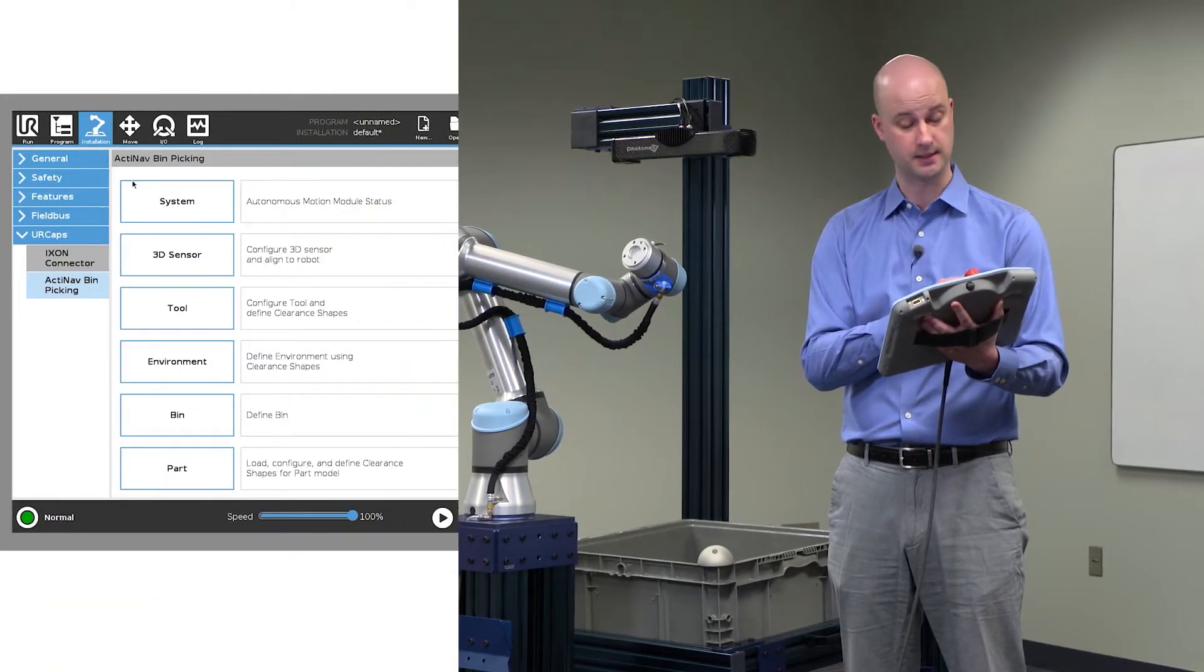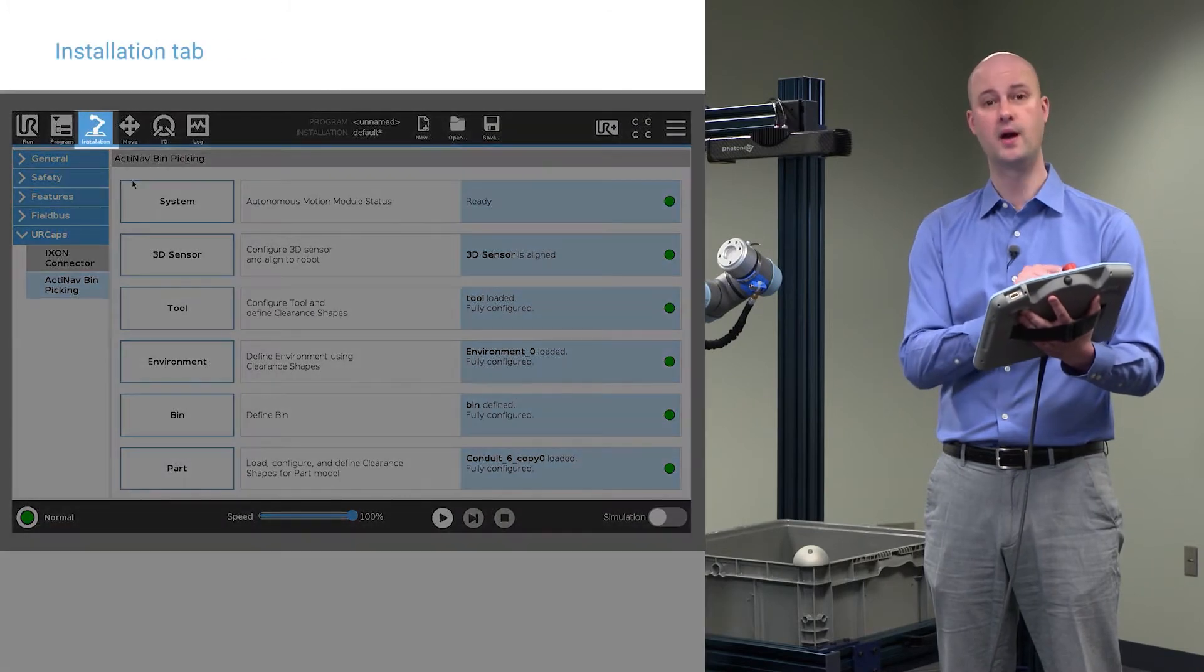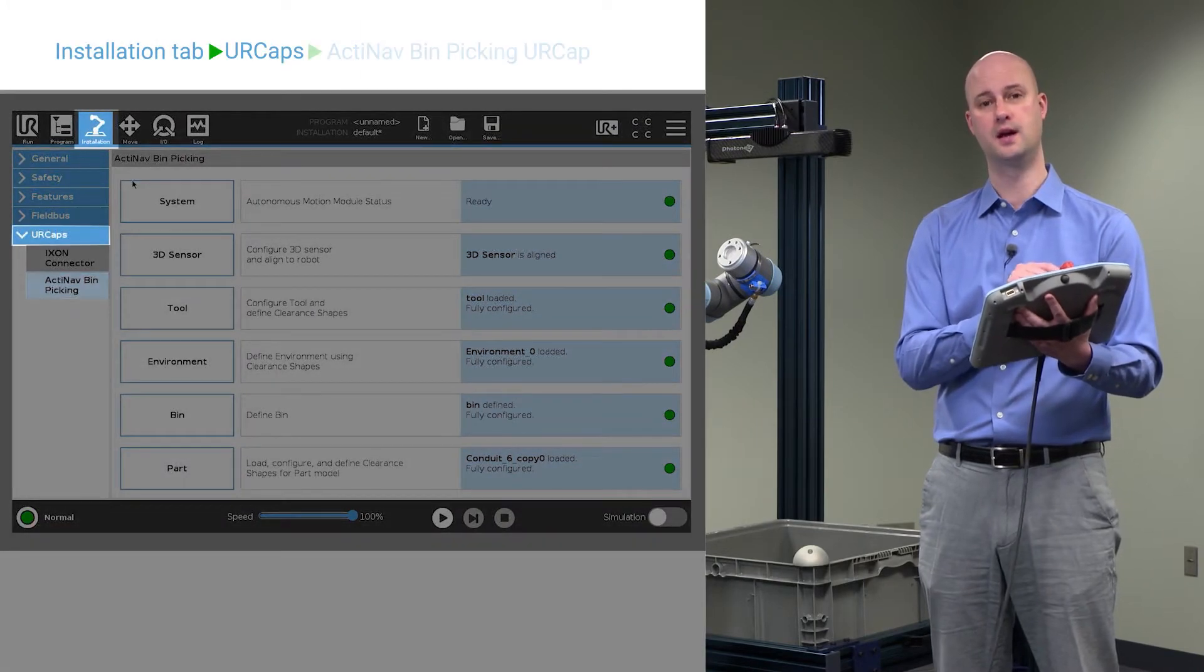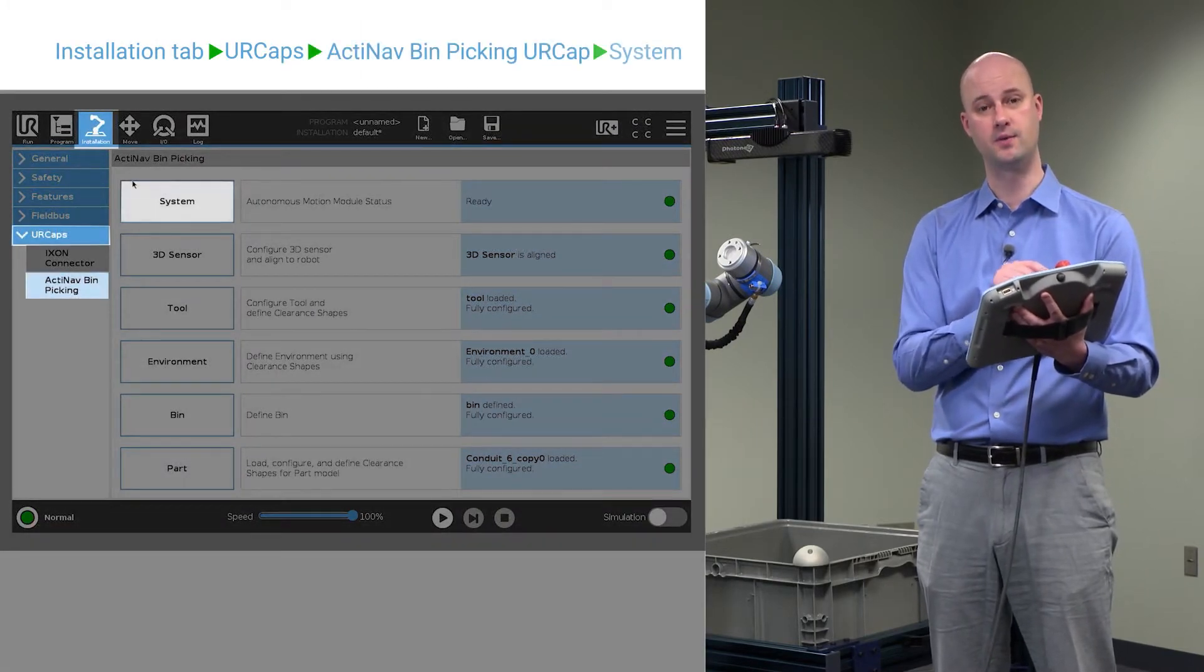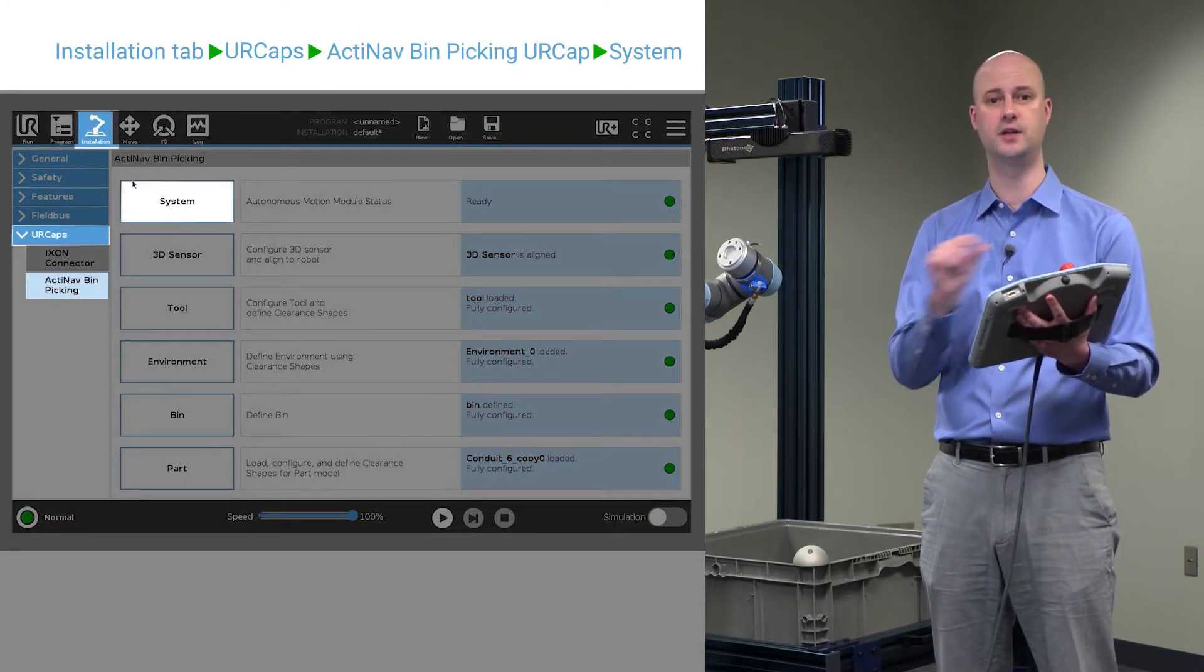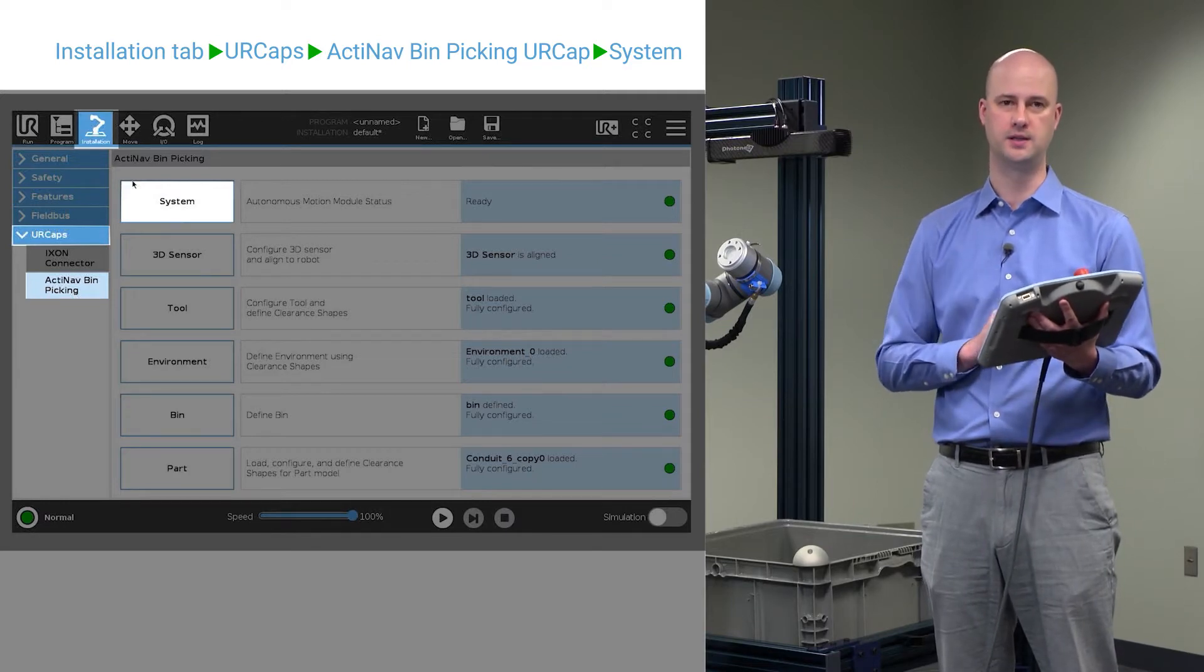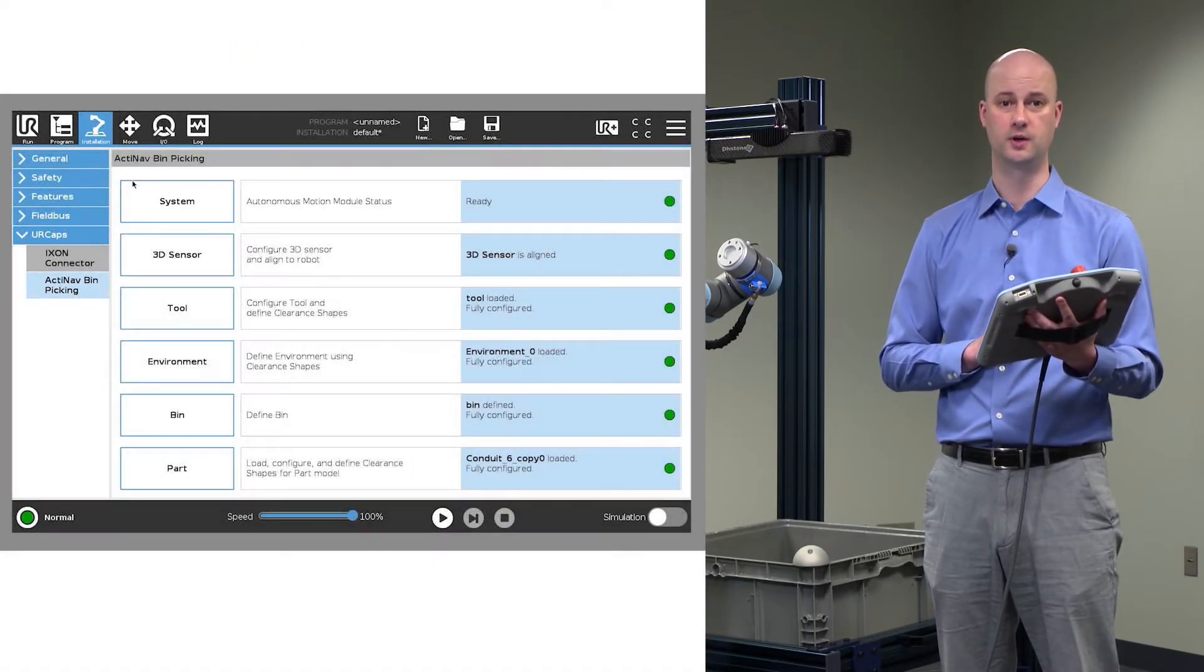When you click Step 1, System, you'll see the system state, whether the Autonomous Motion Module is actively communicating or not with the E-Series Controller.